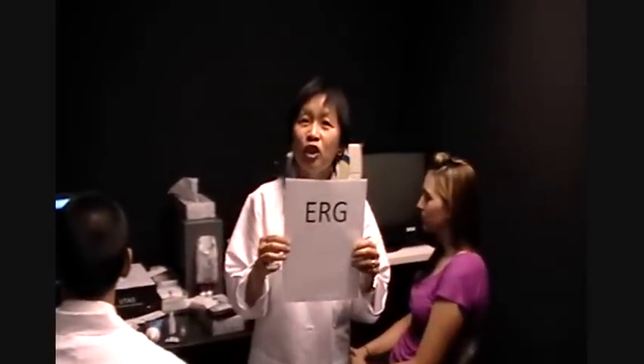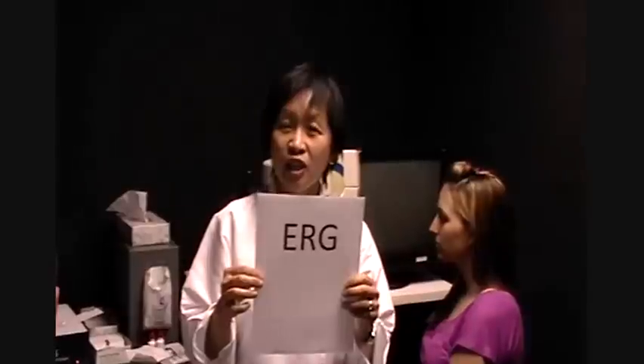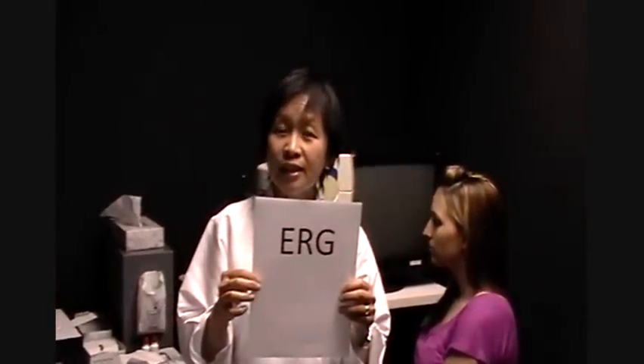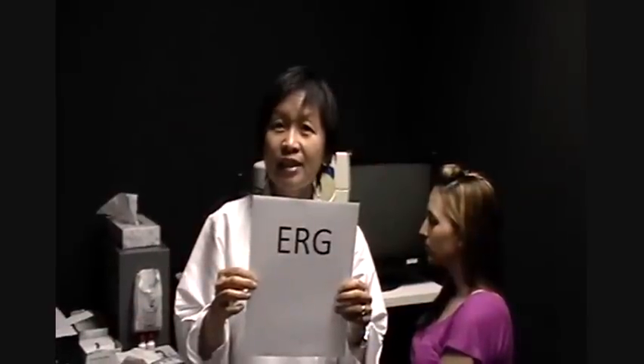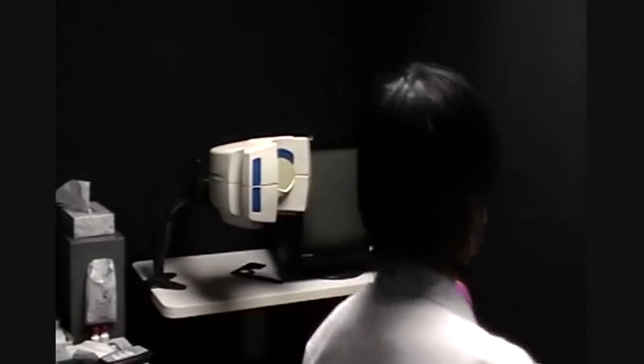Thank you for joining us. We're going to show you how to hook up a patient for an ERG, an electroretinogram. This is using the LKC technology system and DTL electrodes from Synopsys. Here we have Allison, who is going to be our volunteer.